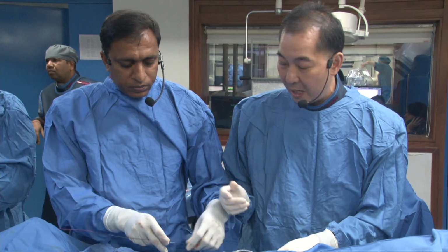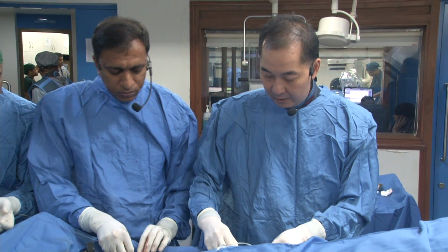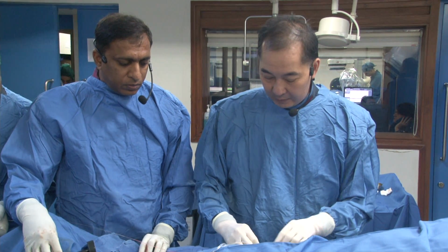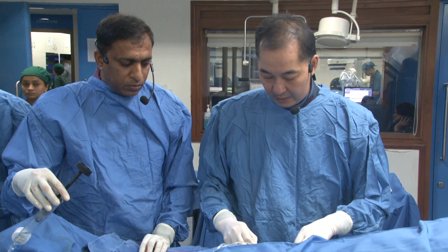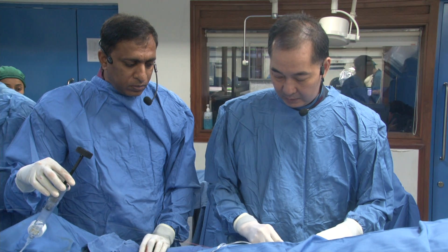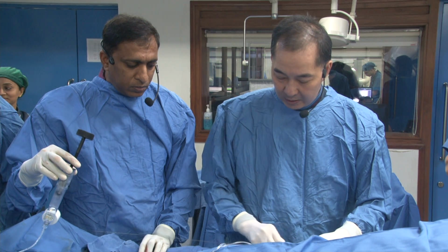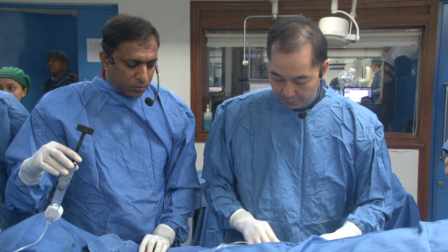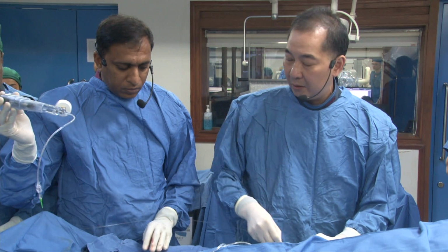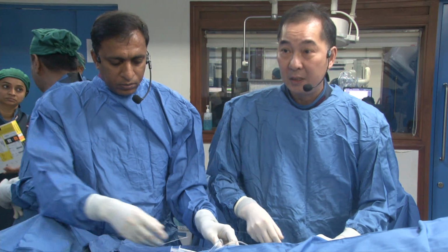Okay, so I put the side branch balloon first. What about the one option of kissing first and then just stenting the PLV alone? Just to kiss before stenting so that the plaque shift will not be much, and the plaque can get reorganized favorably, and then just stent the PLV alone. Is it a possibility? You want kissing before the lesion first? Right, I'm still against doing anything crazy about the side branch. I don't think it's a good idea just to do a kissing.